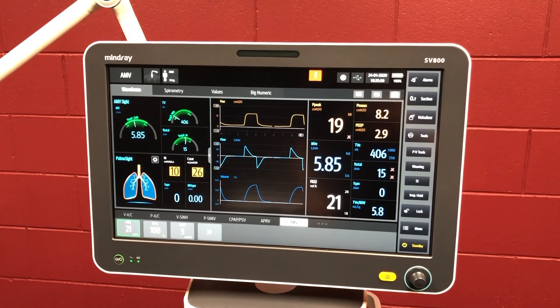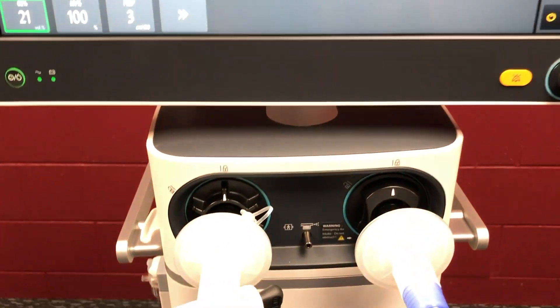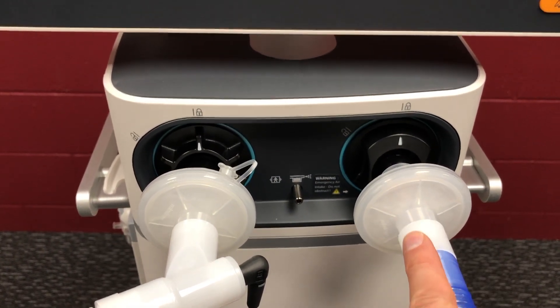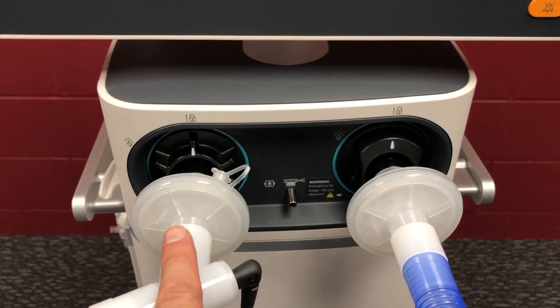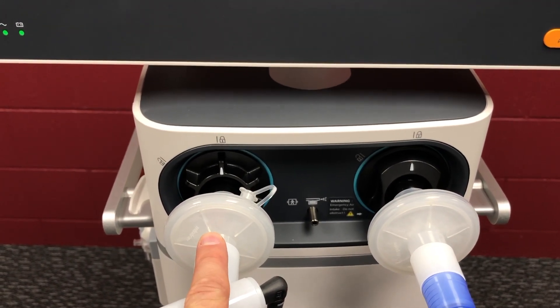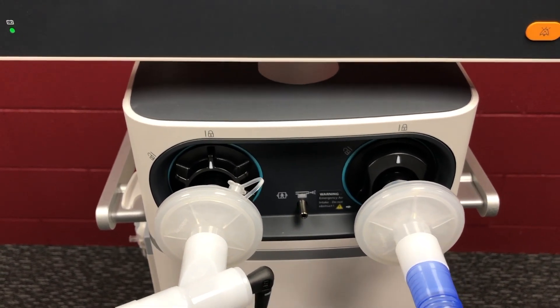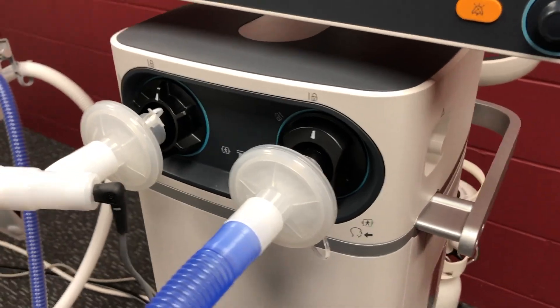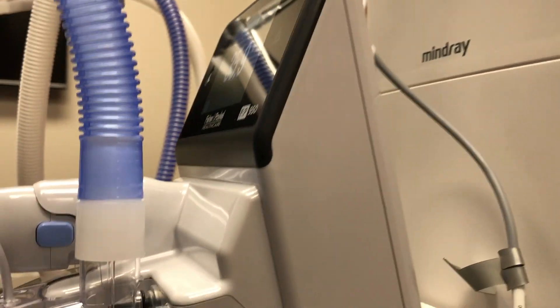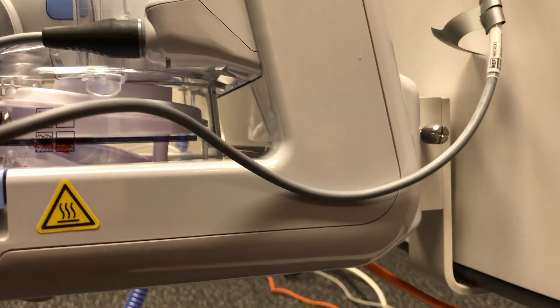Coming in a bit closer we've got our main display on top. In the front here we've got our inspiratory limb with a filter and expiratory limb with filter. It's also where the flow sensor sits in the back of, and we've got a nebuliser port there as well. A little bit further down there's a bracket down here that fits the Fisher & Paykel humidifiers no problem at all — they just slip right in.